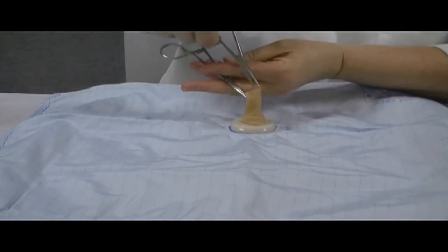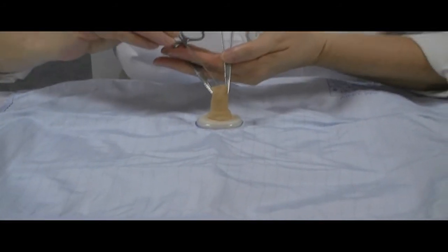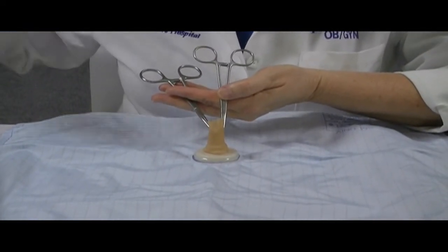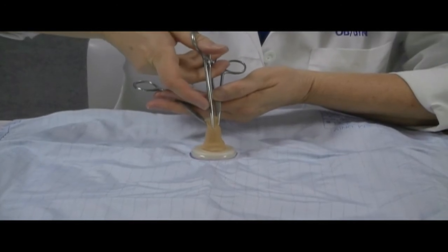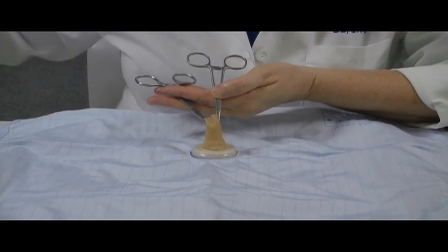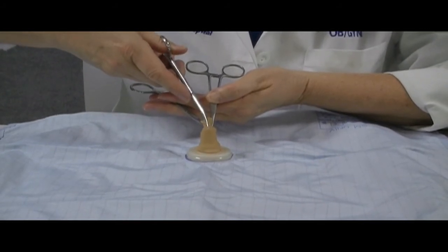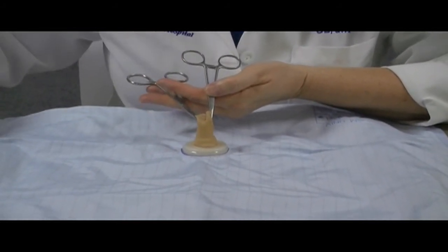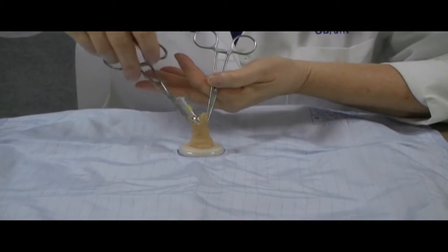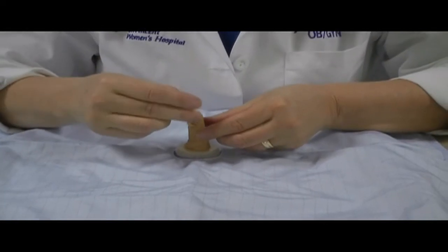to grasp the foreskin. We will simulate reducing any adhesions using either the hemostat or the large probe. Then we will crush the tissue at approximately 12 o'clock using a third hemostat, and then always being sure that we keep the tips up on our scissors. We will place that inside the foreskin and incise the foreskin, and then we will use the Gomco bell to place it inside over the penis, removing our hemostats, place that inside over the penis.